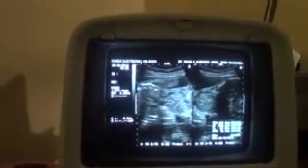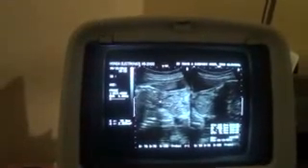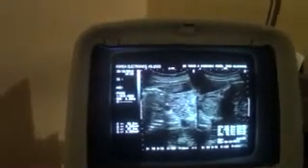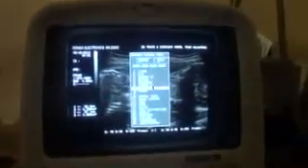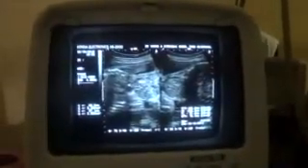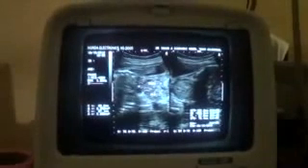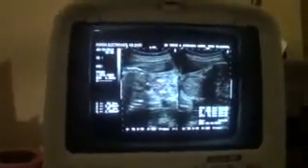This appears to be the posterior lobe of the mass, and this appears to be the anterior part of the mass. So a bilobe mass can be a thyroid mass. So my finding will be a mass relating to the anterior portion of the neck, anterior neck region.